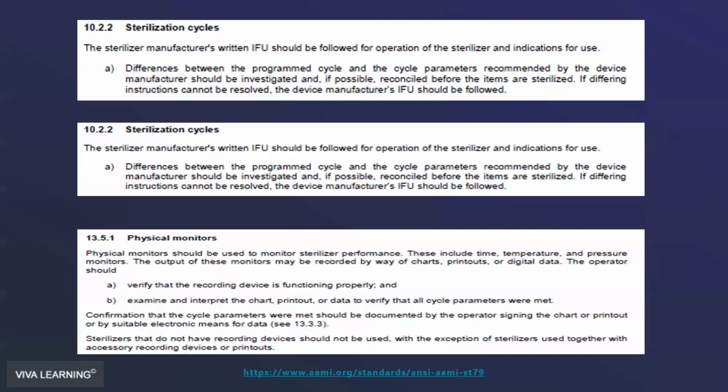Probably not. But what if your sterilizer manufacturer says it's okay to stack cassettes, and now I've got too many stacked if I could squeeze them into the chamber in the sterilizer, and perhaps the cassettes in the middle of the stack don't get good steam penetration. So that's why you need that indicator strip inside of a cassette or inside of a pouch that has only an external indicator.